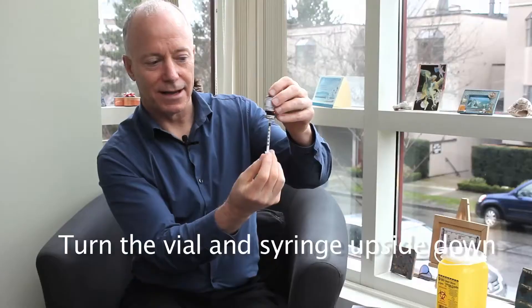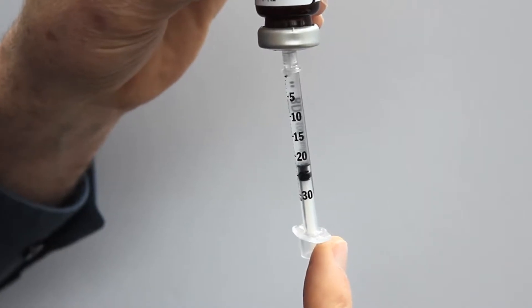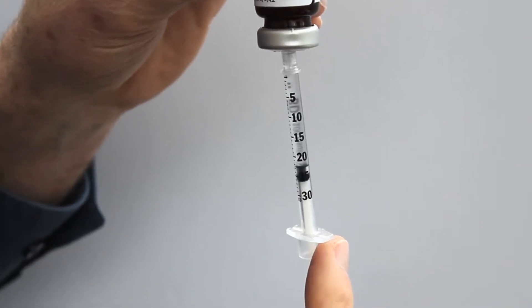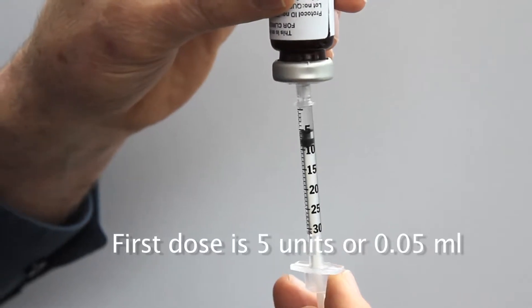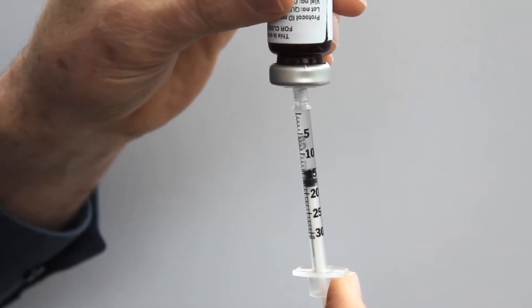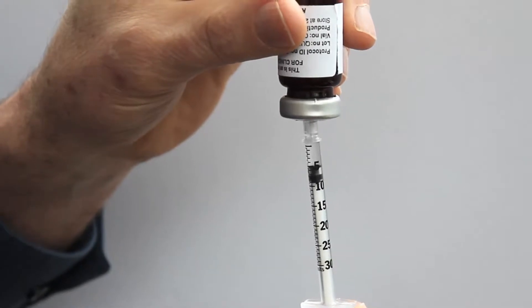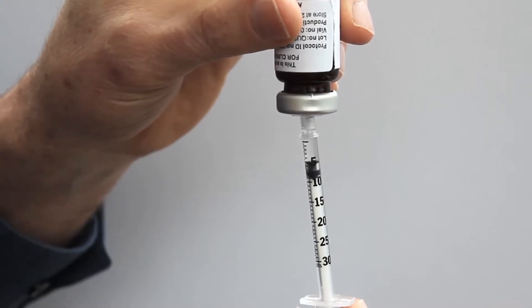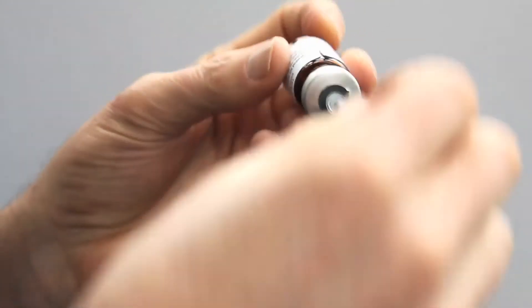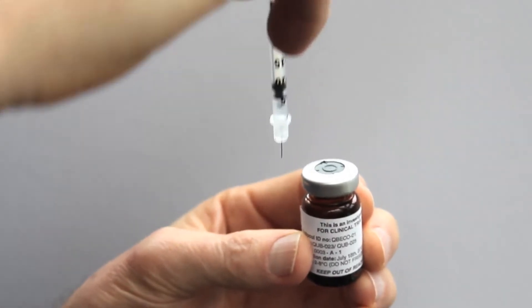Turn the vial upside down and draw the study treatment into the syringe. The side of the syringe has measurement units: 5, 10, 15, and 20. Your first dose is 5 units, which is 0.05 mL. You can pull back more than you need and then inject the excess back into the vial so that you have exactly 5 units. Once you have the right amount, turn the vial right side up and pull the syringe and needle out of the vial.